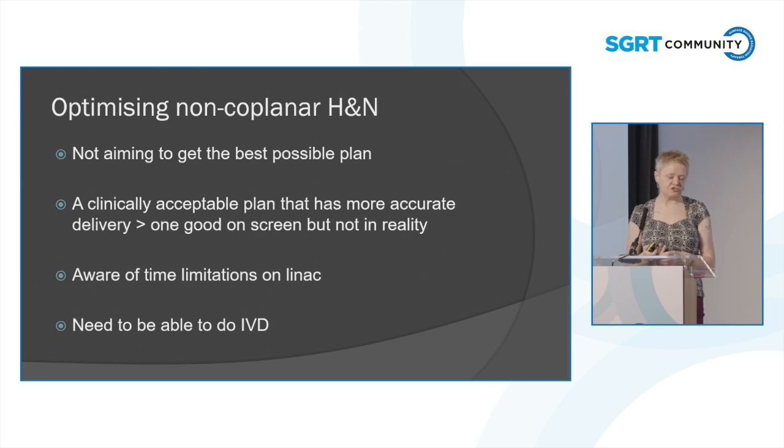And also, we need to still be able to do in vivo dosimetry. So there's no point having a field that will come in, using MapRT, you could get a field coming in from this area. What we couldn't do on the machine is actually check that it is delivering correctly because we use the imager panel to do the in vivo dosimetry, and that would hit the couch. And this is one thing the clinicians did not want to lose. They didn't want the best possible plan delivered, but no way of checking that it was actually the best possible plan.